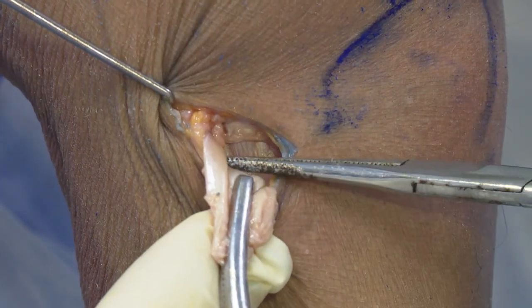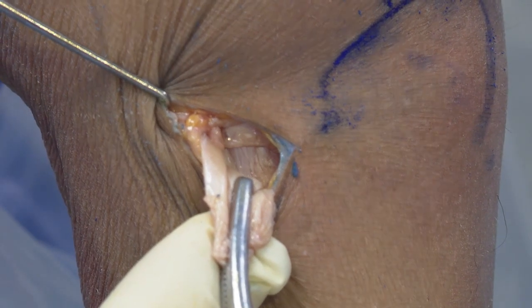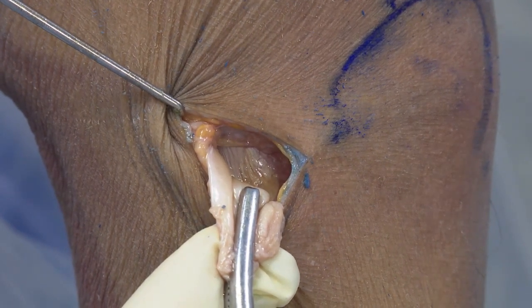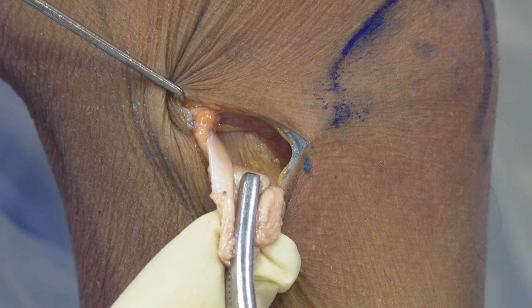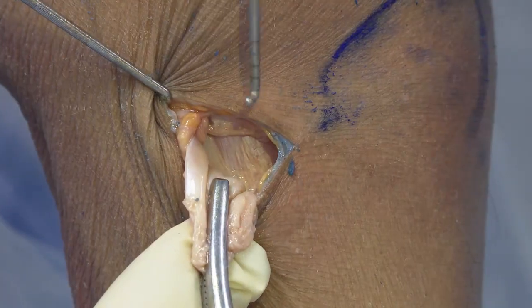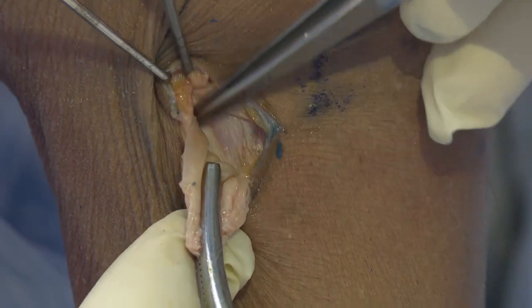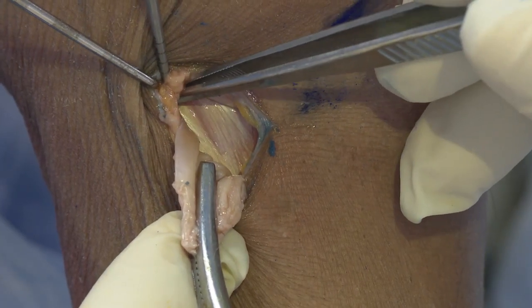Okay, and next step is to... Okay, thank you. Very good. So now I show you the inner side is the MCL here. 那里面呢是有MCL的。Underneath here, this MCL. You see here? This MCL. 右手这个镊子指的地方。看到吗？这个is MCL, the anterior bundle. MCL. Yeah.